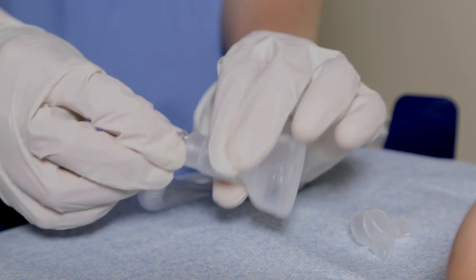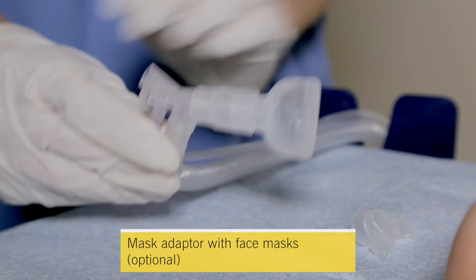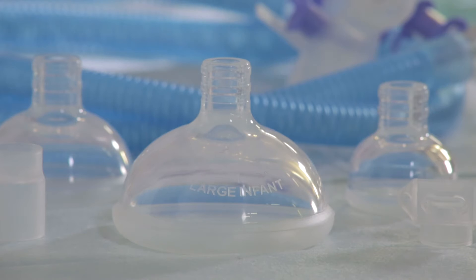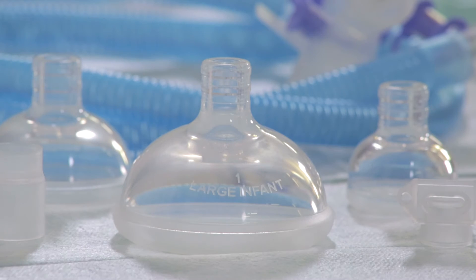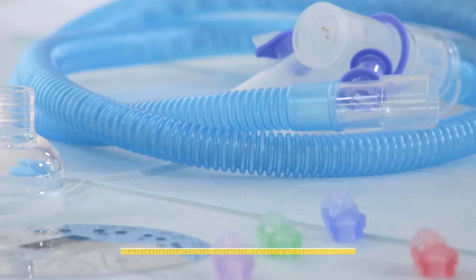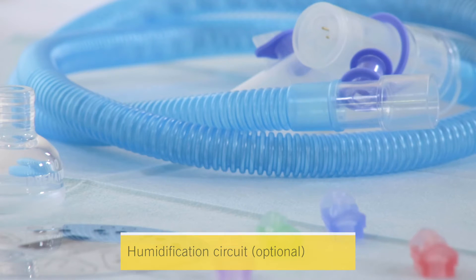If face mask resuscitation is required, you will also need a mask adapter with an appropriate sized face mask. The face masks come in three different sizes: double zero, zero, and one. A headband is included for fixation and for ongoing respiratory support, and an optional humidification circuit is available.